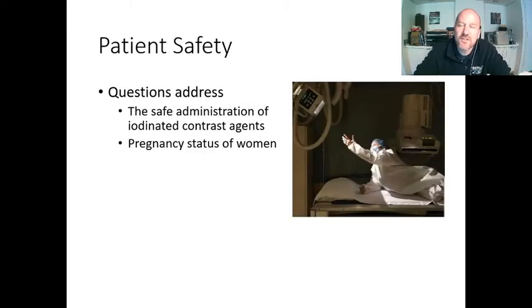So the patient safety questions that we have are twofold. First is making sure that they're not pregnant, so we'll ask the last known menstrual period, and we'll kind of calculate from there, right? Ideally, we would do the scan within 10 days of the last known menstrual period, because that's kind of a make-it-or-break-it time for a child. If the patient had conceived, it's kind of an all or nothing thing during those first 10 days of pre-implantation, and we'll talk more about that in radiation biology. But last known menstrual period is helpful for us.